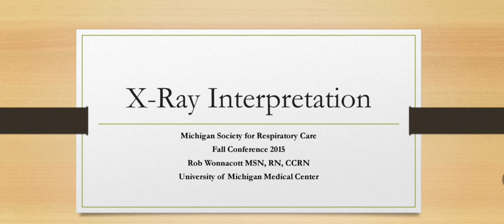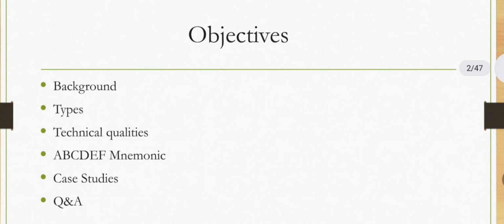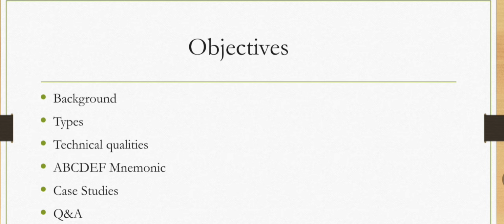X-rays interpretation by University of Michigan Medical Center. The objectives of this lecture are to discuss background, types, technical qualities, the A, B, C, D, E, F mnemonic, case studies, and question answers.